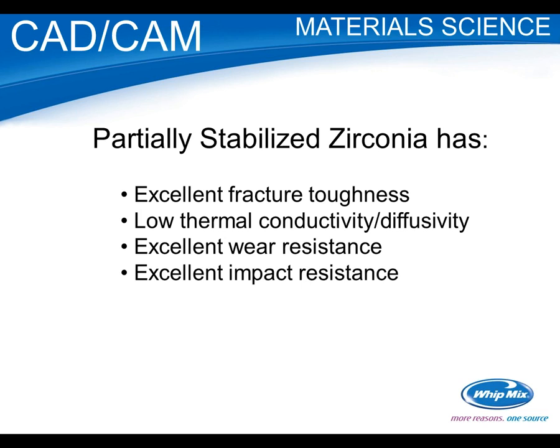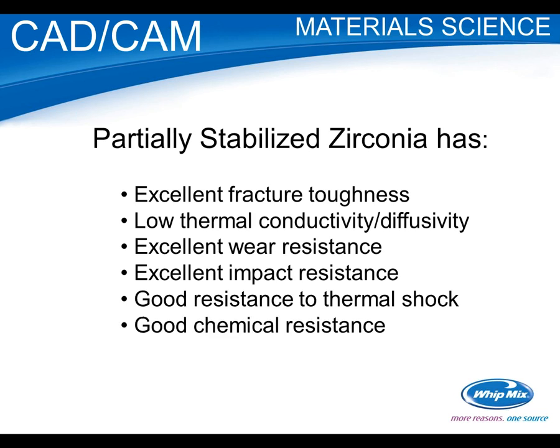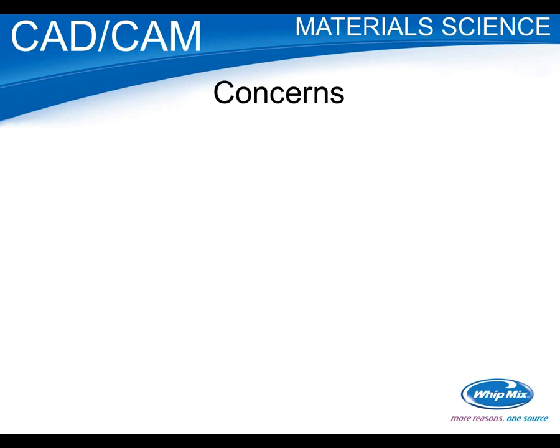Excellent wear resistance. Again, very strong material. Excellent impact resistance. You could take a zirconia abutment and hammer it into a board like a nail, and it's not going to crack. Good resistance to thermal shock. So if you think of glasses in the old days, I think it's pretty well adjusted now. But if you cooled them too quickly, if you took a glass and put it in cool water, it would crack. Zirconia is not going to do that. You can go from very hot to very cold very quick without any detrimental effect. Excellent chemical resistance and corrosion resistance, and both of those are partly why it's so ideal for medical. It's just a very stable material.